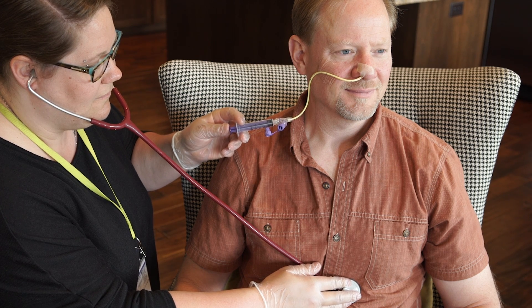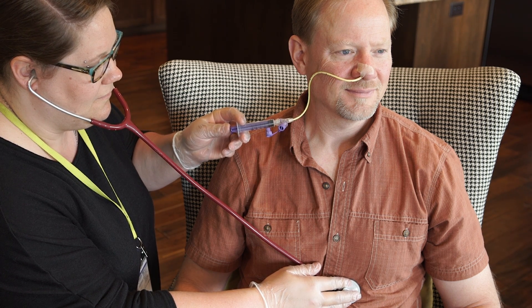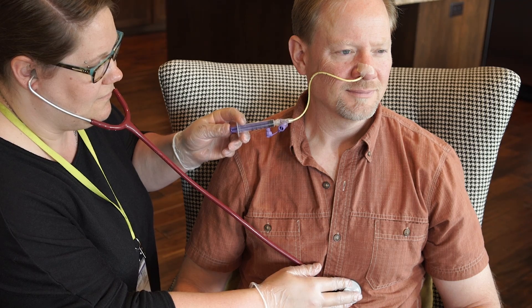If you do not hear the sound of air entering the stomach, follow the plan of care for replacing the tube.